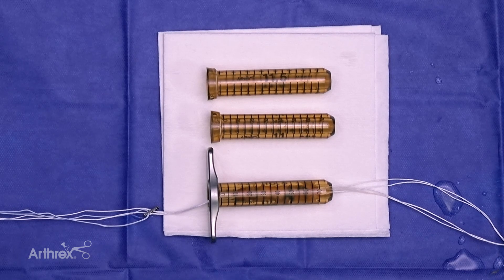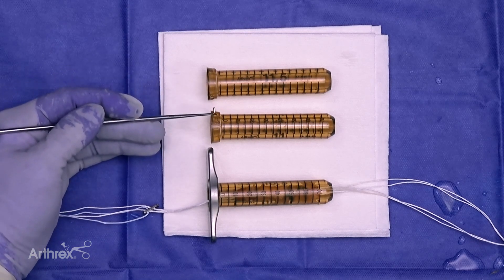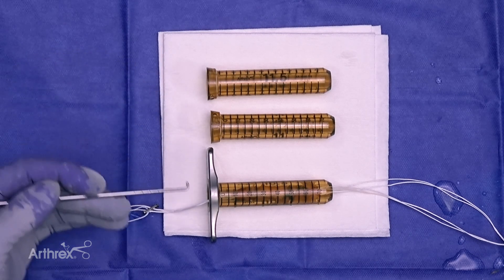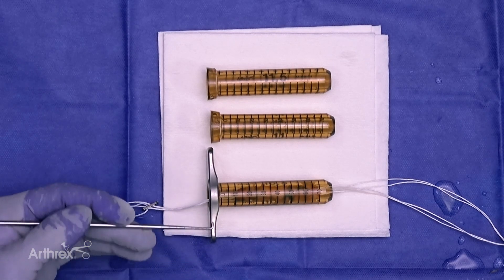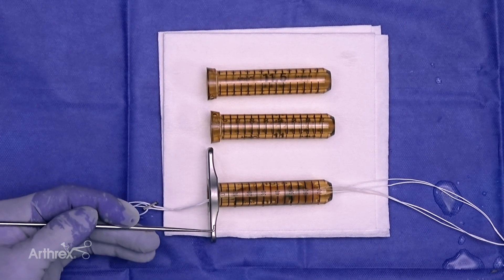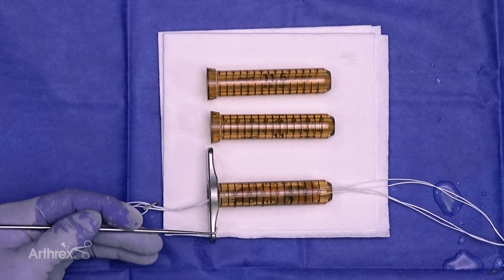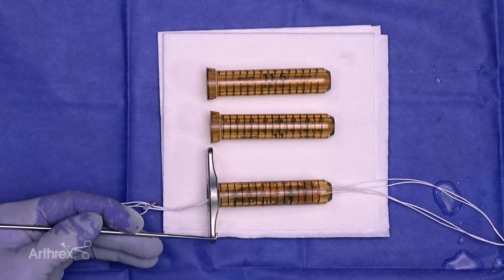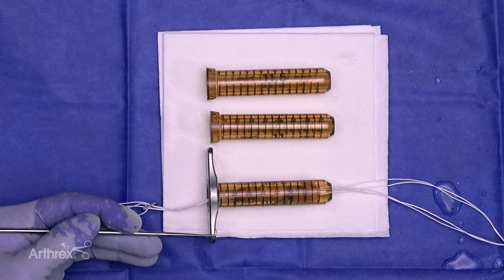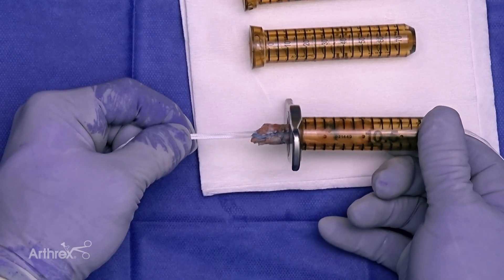During graft preparation, we use the compression tubes. These enable us to take a large volume of collagen and compress it. An 11.5 or 11 millimeter soft tissue graft can be compressed serially down to 9.5 or 10 millimeters. This allows us to do line-to-line sizing with the smaller diameter, knowing that when the graft begins to expand during biologic healing, we have more compression and filling of the socket. This minimizes effluence of synovial fluid into the socket and reduces tunnel widening. Here is the graft as it comes out of the compression tube.